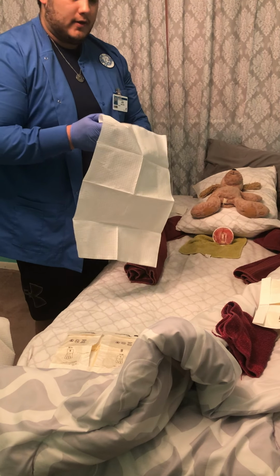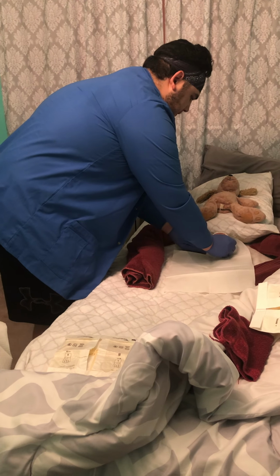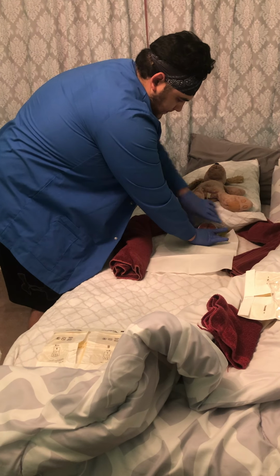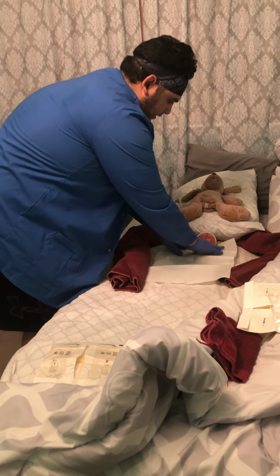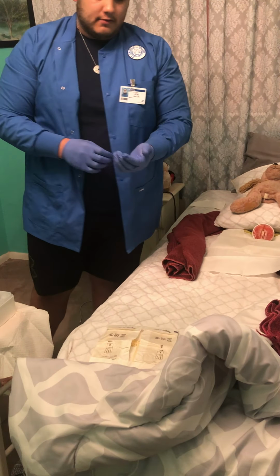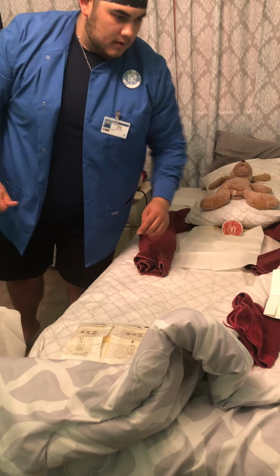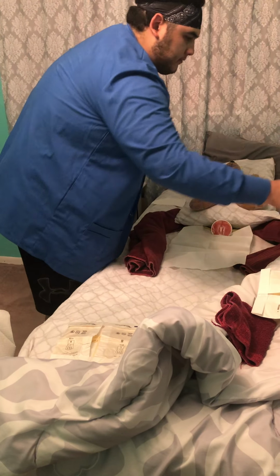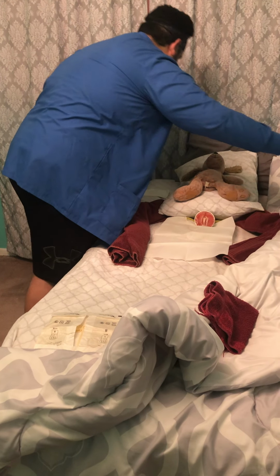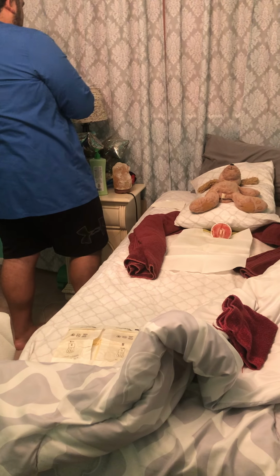So when putting the drape down, you want to do shiny side down. So we're going to come in like that. And so now we're going to go ahead and change into our sterile gloves. Let's go into the discard of this stuff. Here. So I do some hand hygiene.